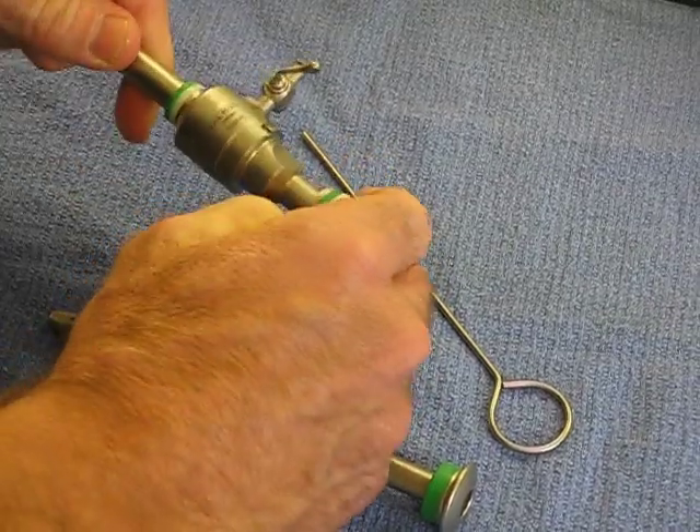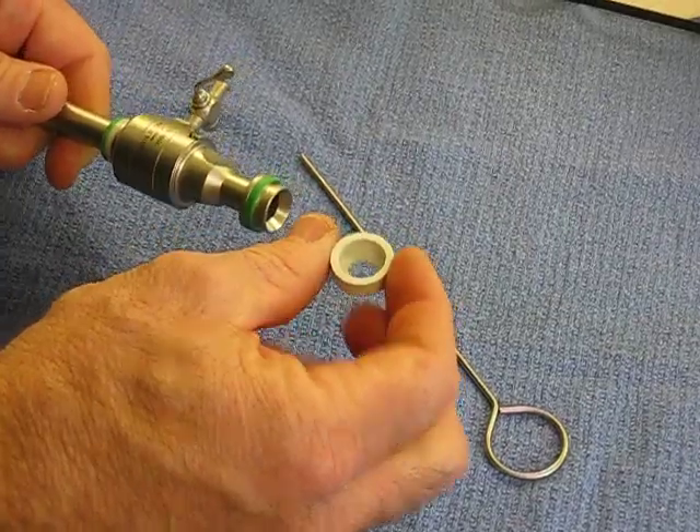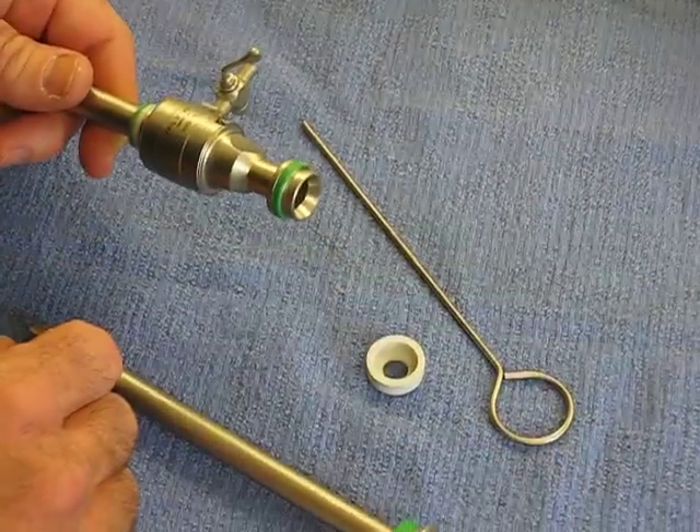You take off the sealing cap and lay that into the Enzymatic Cleaner as well.